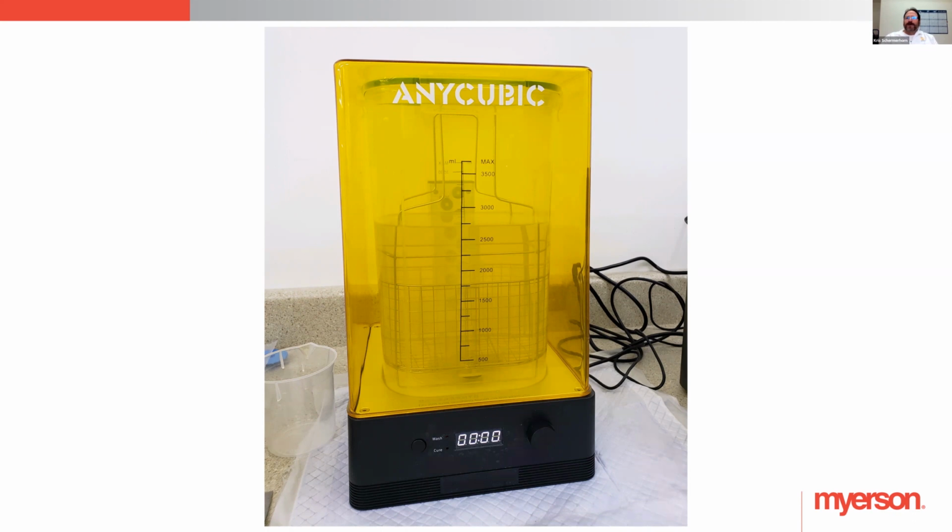So this long answer that I'm giving to you for cleaning is to make sure that you spend as little amount of time in that alcohol as possible. Make sure that you don't have technicians that are going to leave it, go answer a phone, because you will have a greatly deteriorated appliance comparably to what you could have. And again, we are working on a cleaner. It's not released yet. It's a project we're working on that should allow for no concern or deterioration. And I'm sure you'll hear about it once it's available.